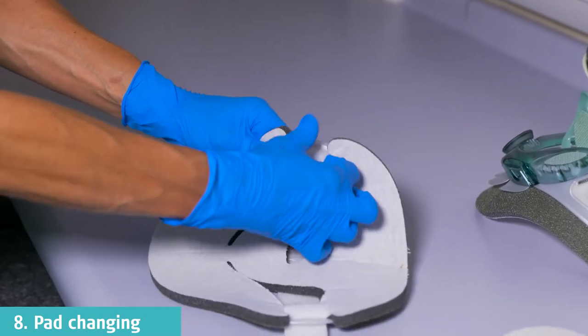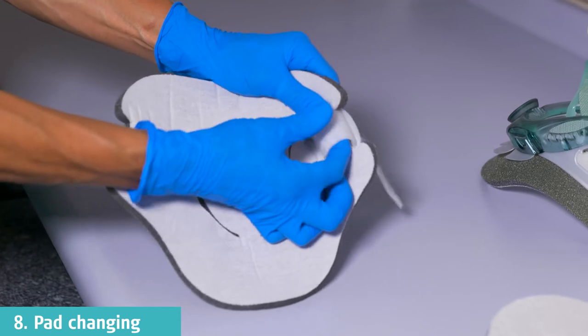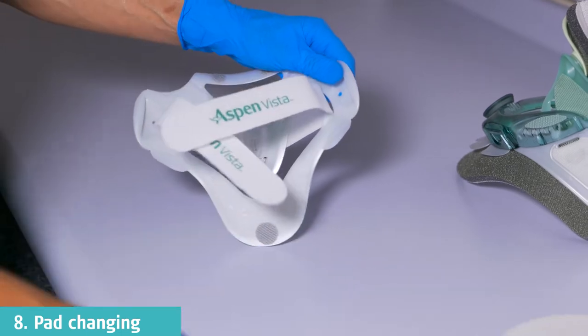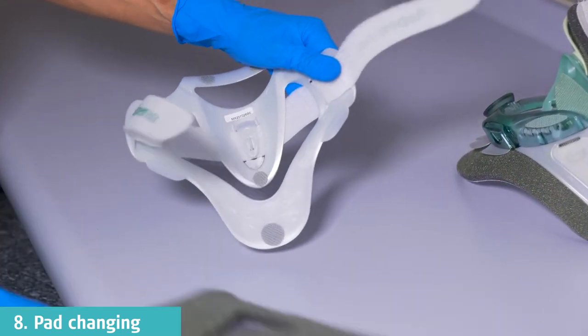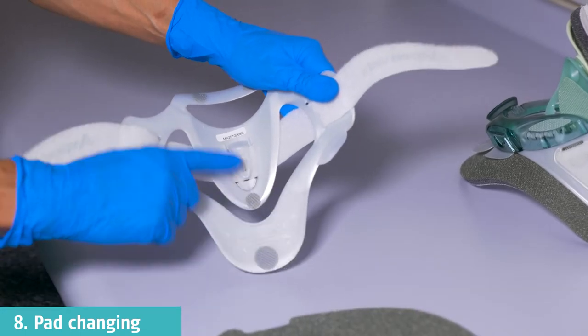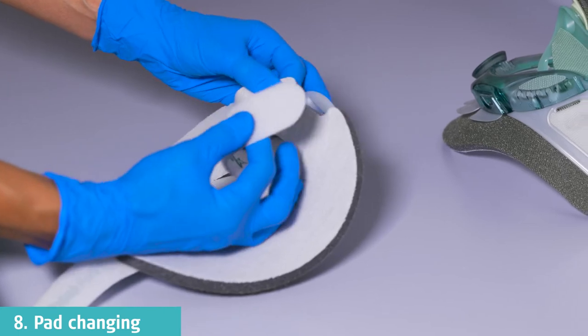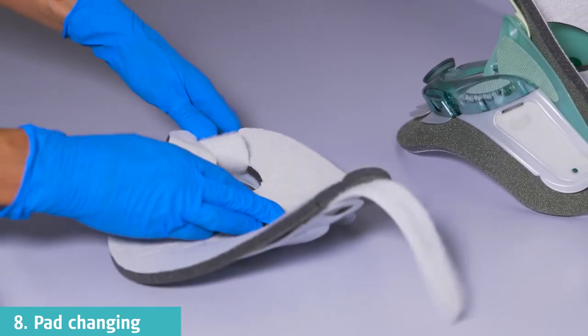To remove the pad on the back panel, unthread the straps on each side and then pull the pad off the back panel. To replace the back pad, begin by attaching the grey-green sides of the pad to the Velcro dots on the back panel. Once the padding is aligned with the plastic, the straps will then need to be re-threaded through the padding and plastic slots.